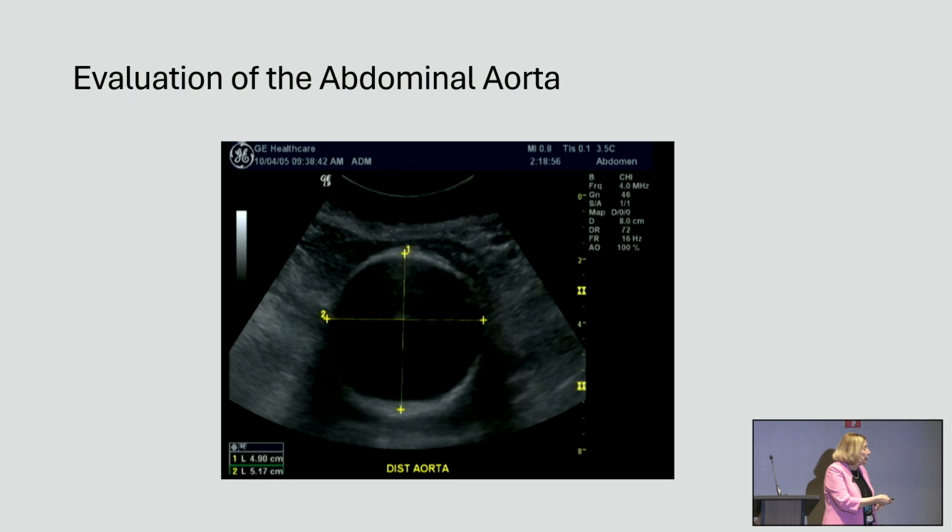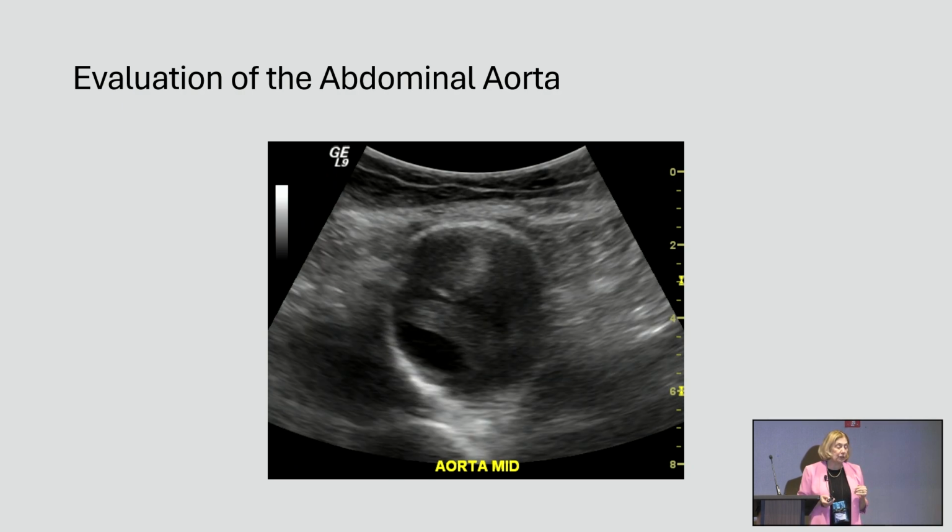Edge shadowing is when around this circle you get dropout, and it can be hard to see that lateral wall. But that doesn't mean you just go up on the circle. And sometimes if you have to get bad data, I would say don't get that data. Just say this is a good AP, I can't really see those lateral walls well, but it looks circular.